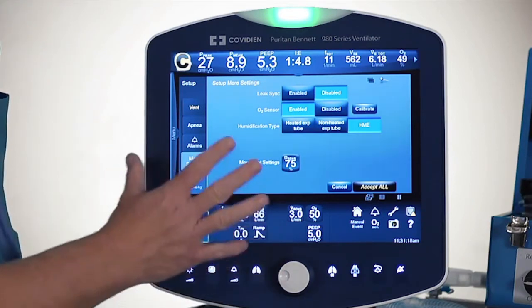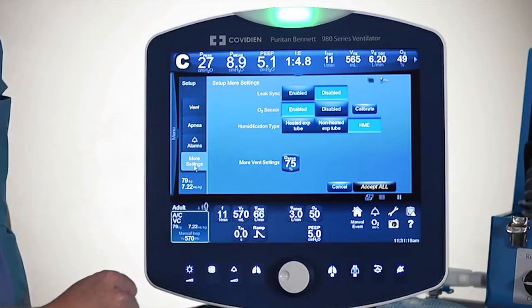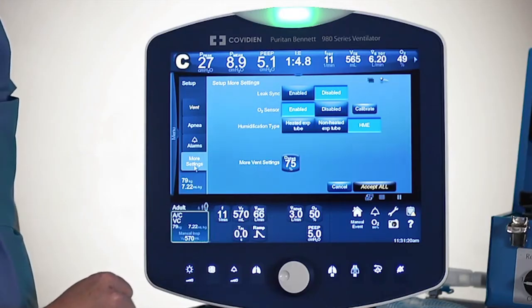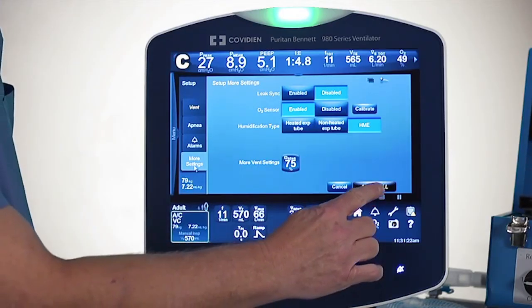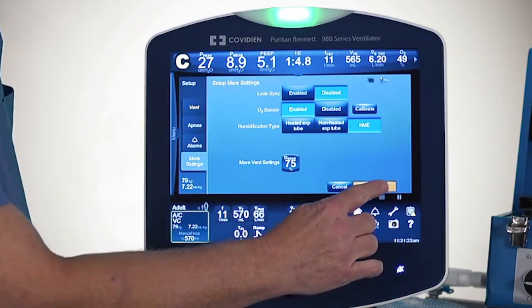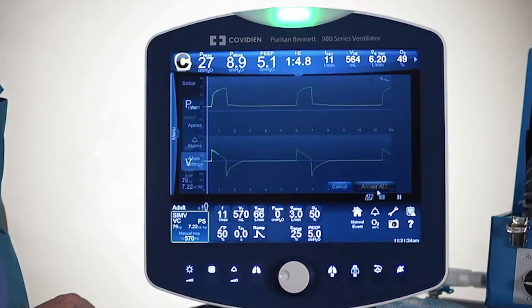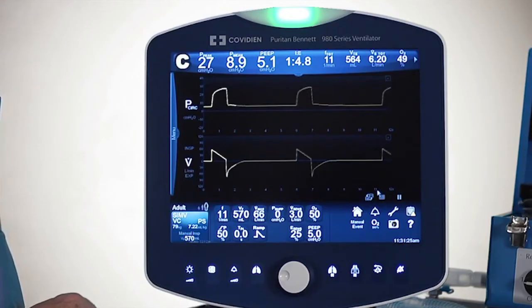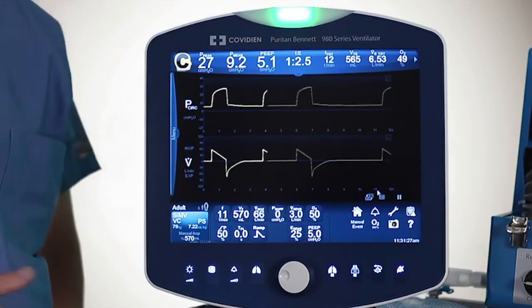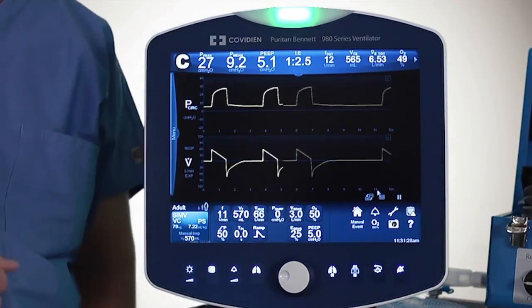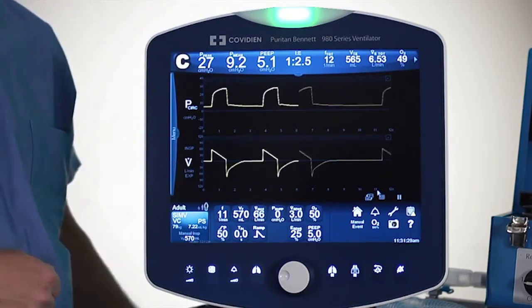Once I'm done with all of my setting changes, I'll come back once again and just push accept all. And so that's how you can facilitate changing multiple settings at one time.